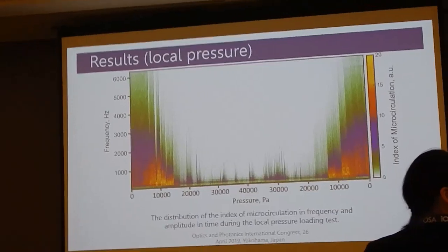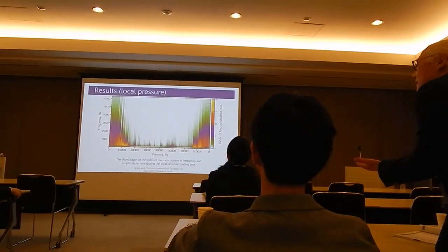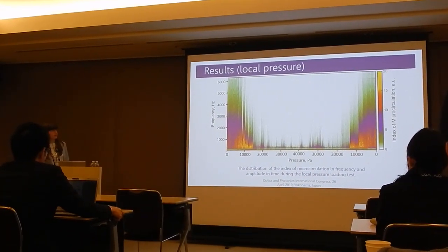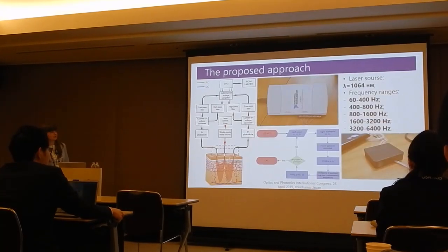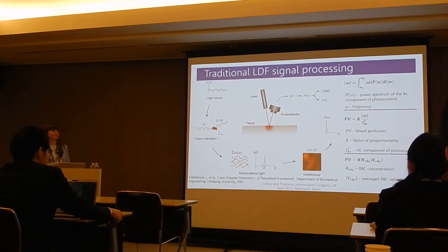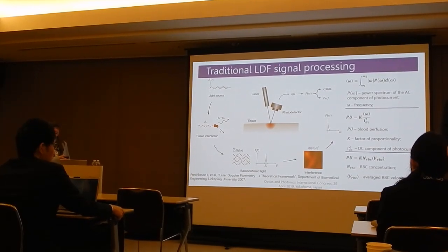So the title of your paper is the use of the Doppler velocity. Yeah. How much is the velocity of the blood cell in the direction of movement? Can you measure it? Actually, the signal obtained is not measured in absolute units yet, unfortunately. It's in relative units, and they carry information about both the average velocity and the red blood cell concentration.